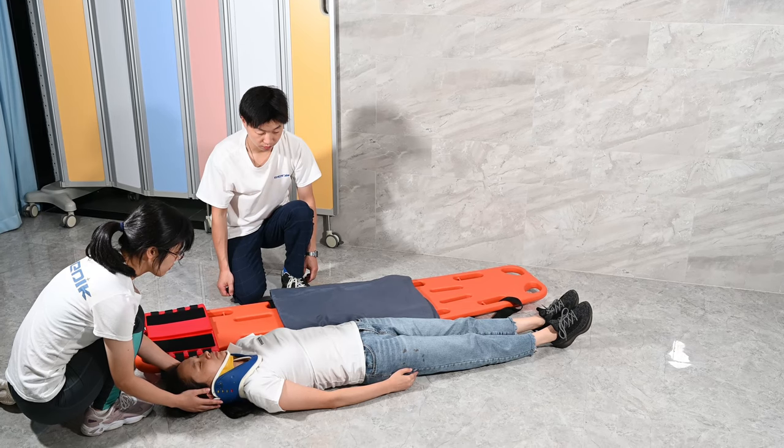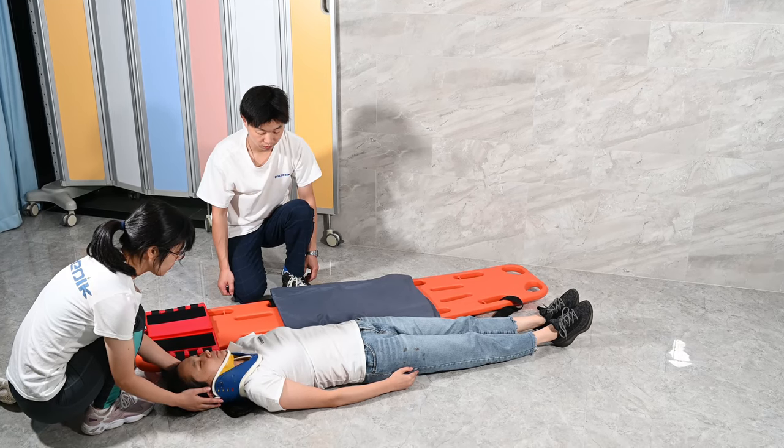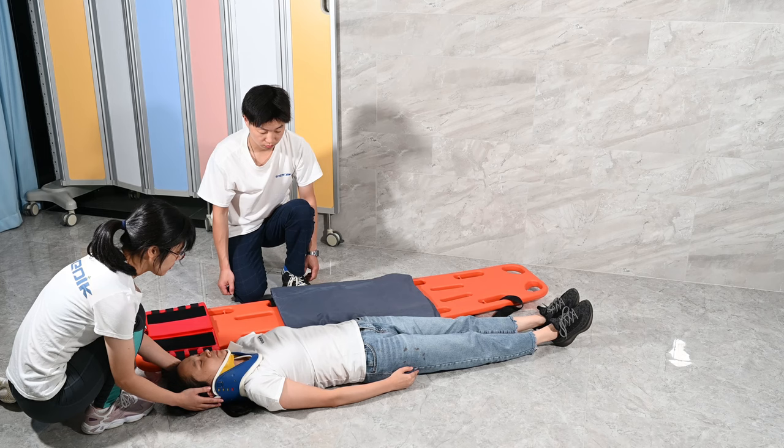Next, we need to roll the patient. After rolling the patient, please lift the board at a 45 degree angle.